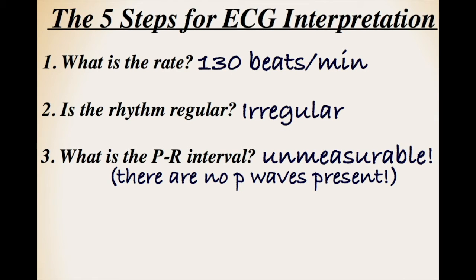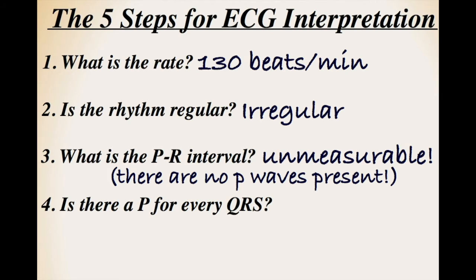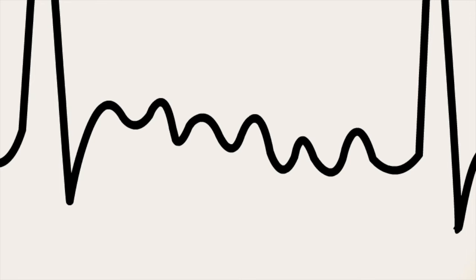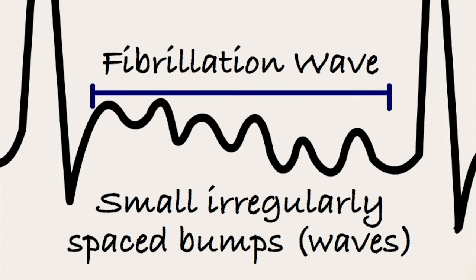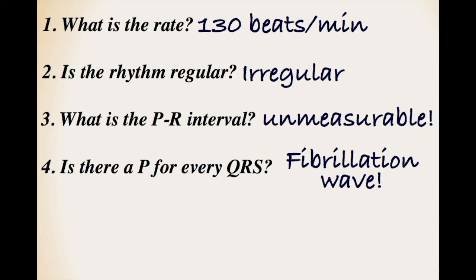Next, we want to check that there is a P-wave for every QRS complex and a QRS complex for every P-wave. As we have already discovered, on this ECG there are no P-waves. Instead, we have what is known as a fibrillation wave. These small irregularly spaced bumps represent the rapid and irregular electrical activity we see in the atrium during AF. A fibrillation wave is another of the diagnostic features of AF.